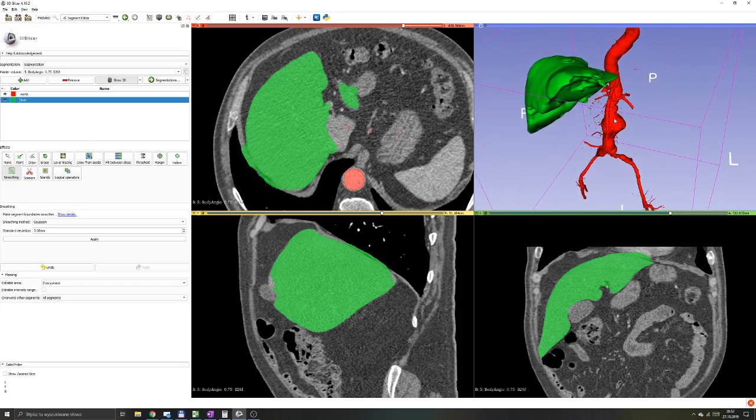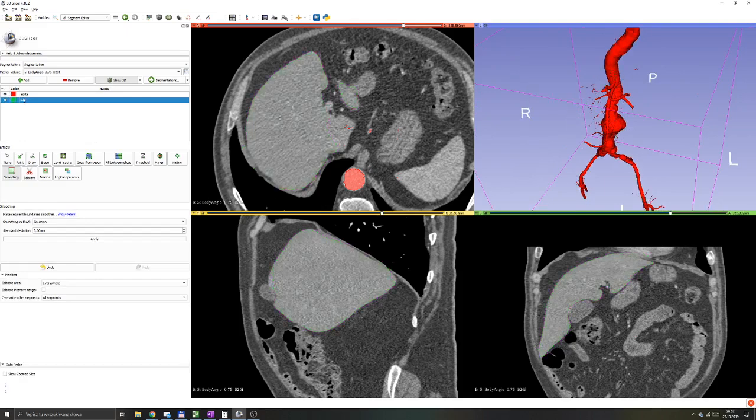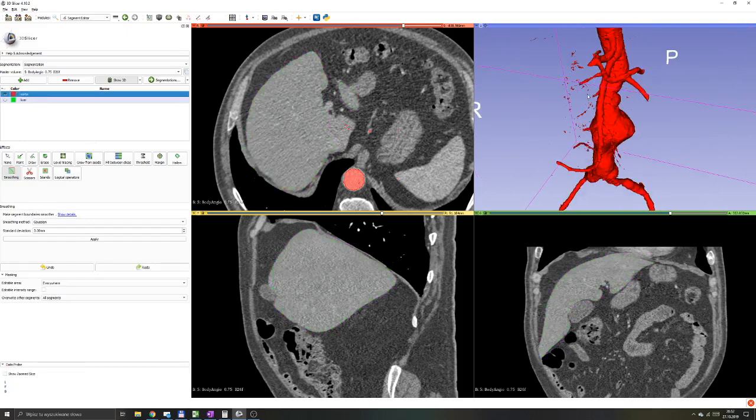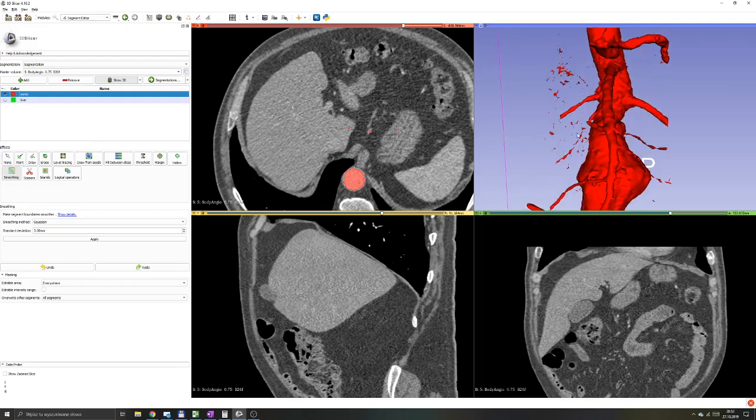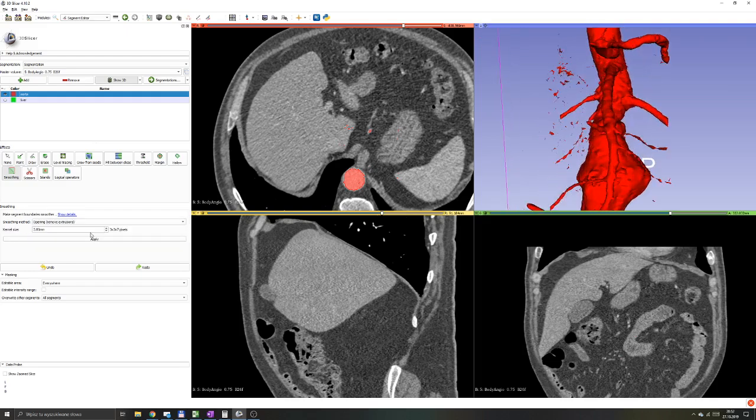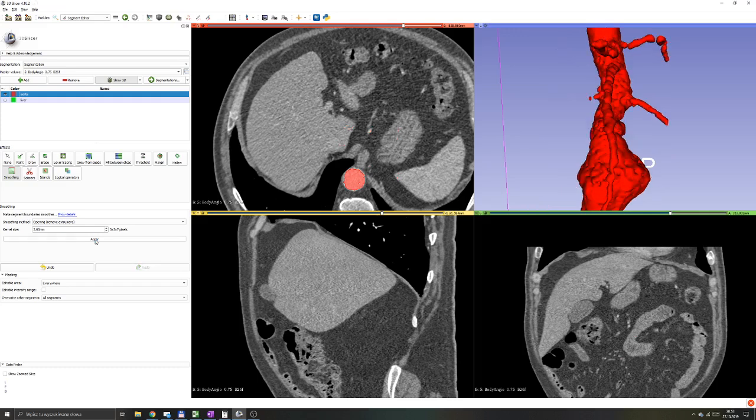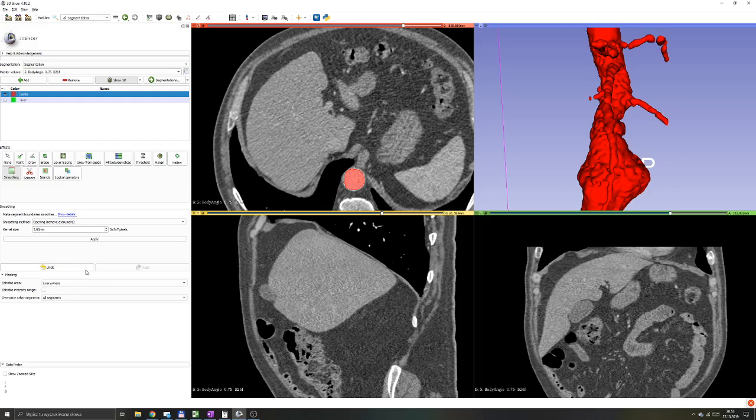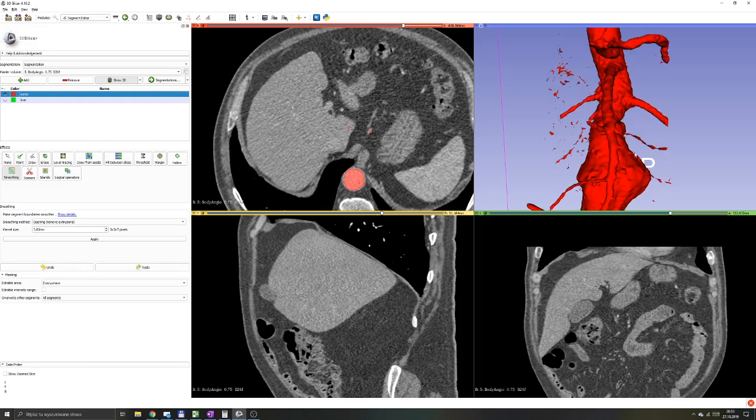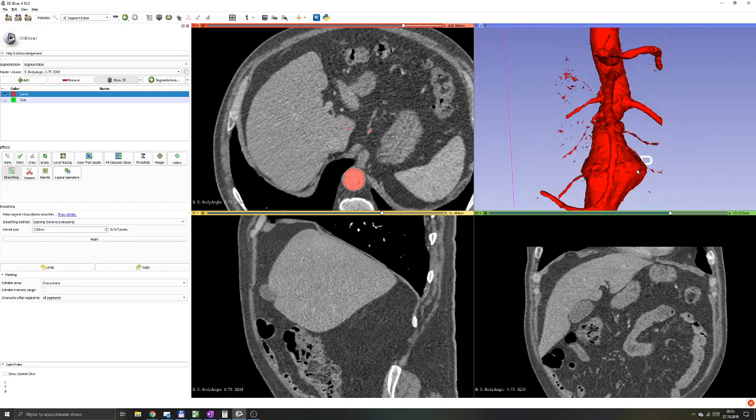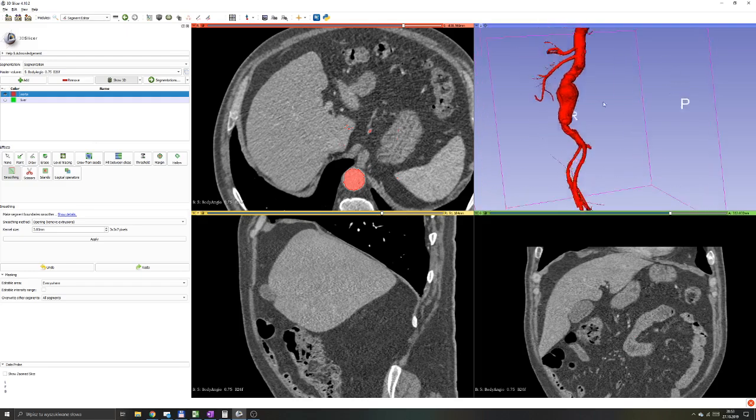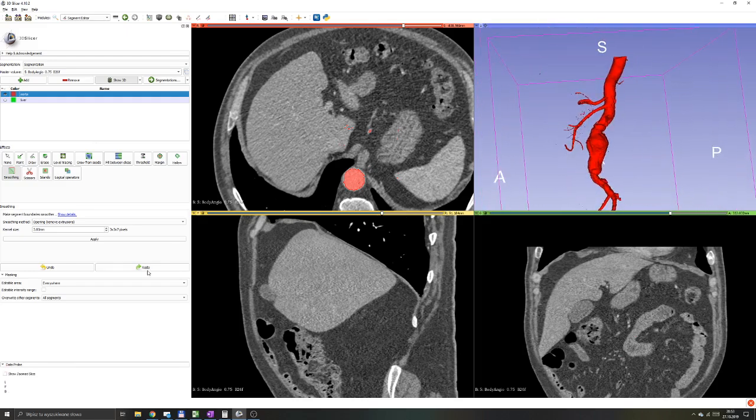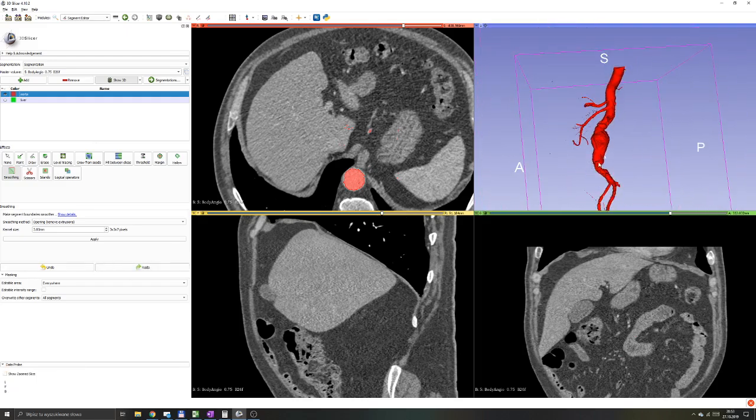Let's try the same with our aorta model. I said that remove extrusions method would be good. Let's find out whether it will work or not. Again, the kernel size over here, you might play a little bit whether three millimeters is too much or too little. Over here, it seems that it removed this noise outside of the aorta. Let's see whether it modified our anatomy too much. Maybe a little bit too much.